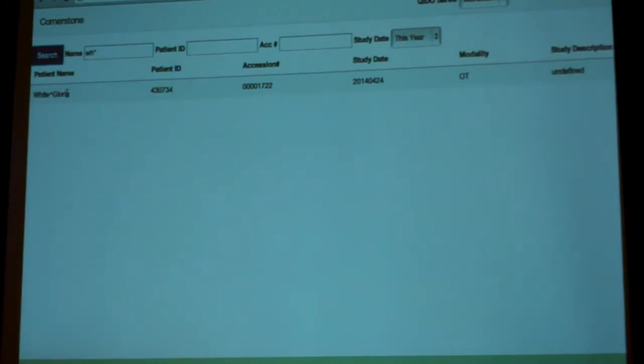This application literally took me about 30 minutes to build, very, very quick, plus 4 hours of debugging, but 30 minutes to actually get it to work. Debugging the back-end system, not mine. And then if I go to the Agfa server, you can see I have to filter it down properly. Like, was it 9151? So that's a query against the Agfa server to actually pull up the study list.